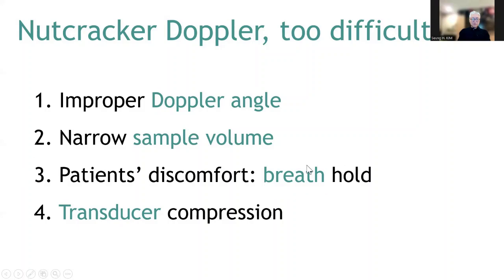So the solution is we do the ultrasound exam while the patient breathes comfortably and continuously.